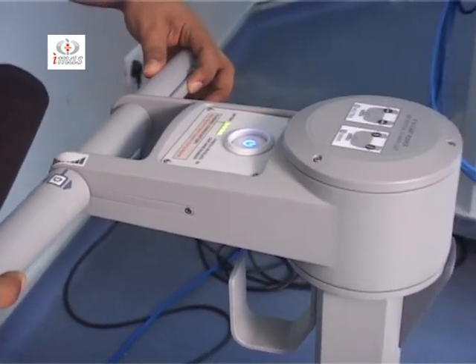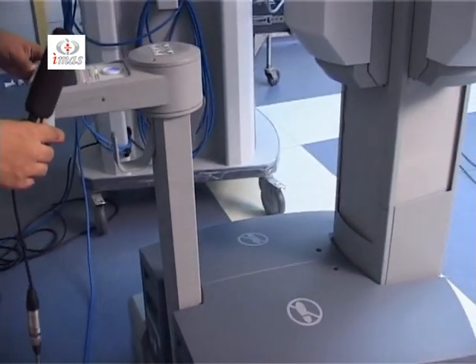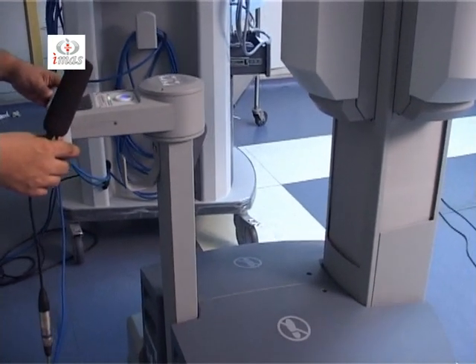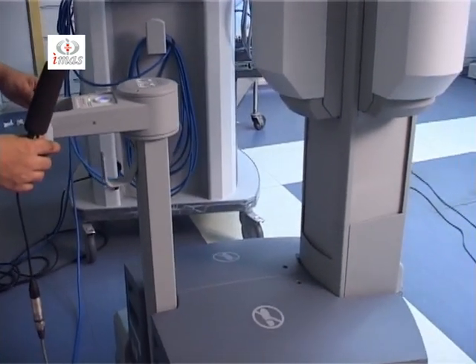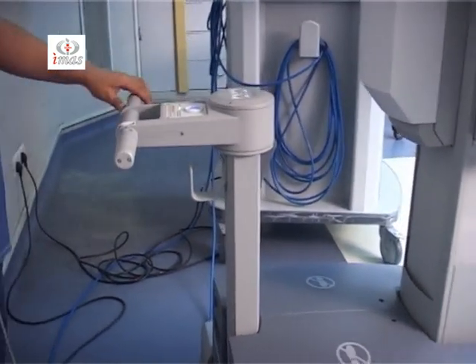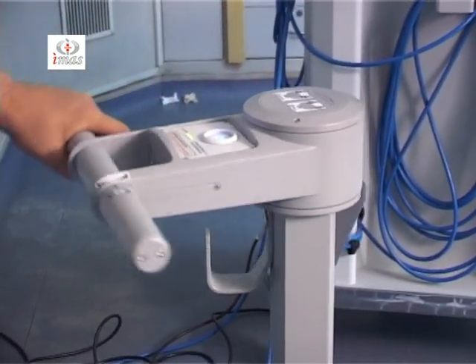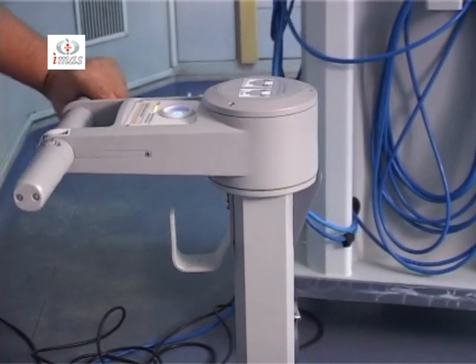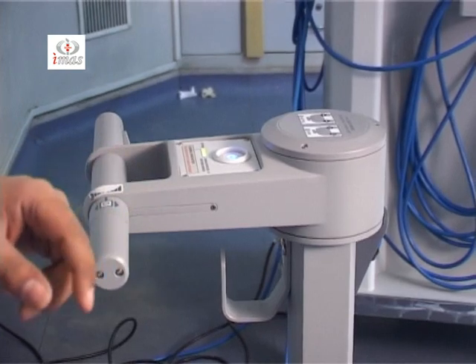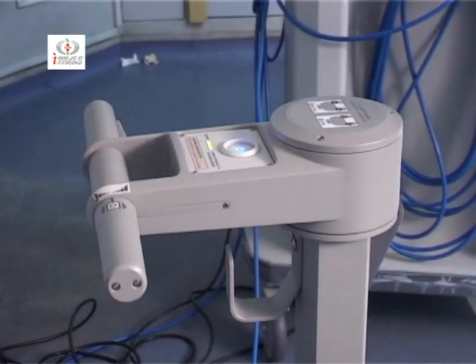See, the cart is moving ahead. The more I rotate the throttle, the faster it will move ahead. And if I rotate it back, it will move backwards. And this can be moved to the left and right by turning the handle in this direction and in this direction. If you don't want to use the drive buttons, you push these shift switches to the neutral position and you can just push the cart manually.